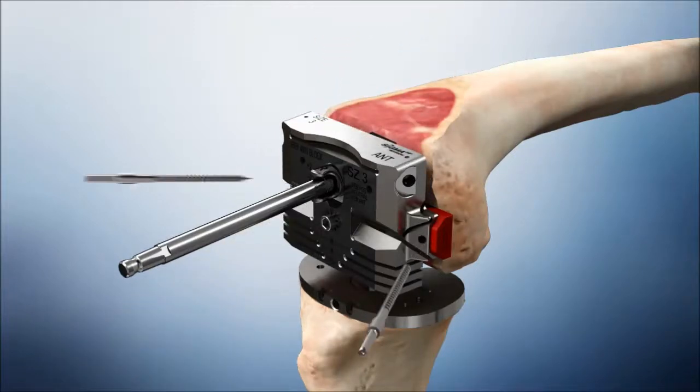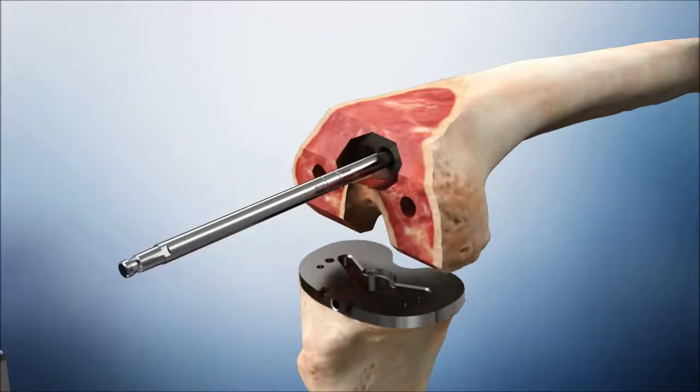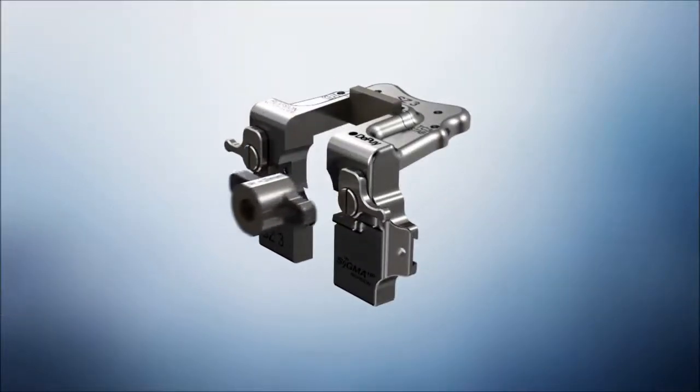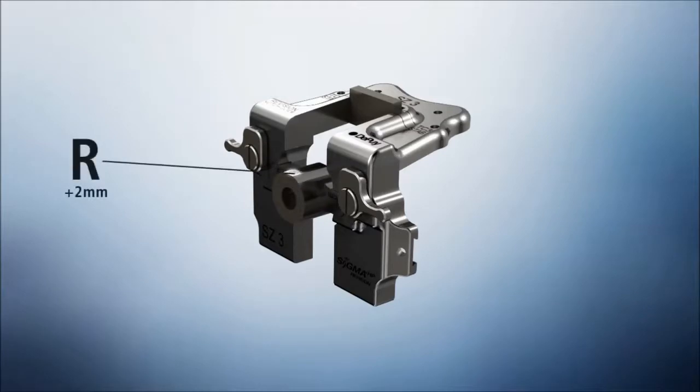Remove the fixation pins and the revision 4-in-1 cutting block. Be sure to remove any bone resections from the prepared surface. Assemble the appropriate notch guide bushing, left or right and +2, 0, -2, to the appropriate size revision notch guide. For proper assembly of the bushing, the correct marking designation will be facing up, here depicted as R +2 mm.